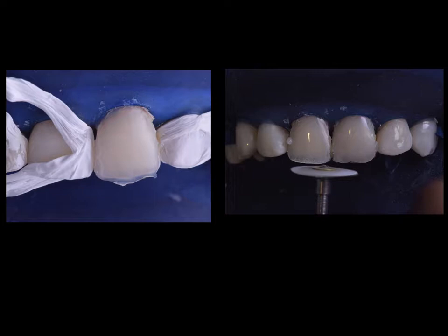As you can see, we used Teflon tapes to separate the teeth. They're highly recommended. You can buy them in any hardware shop. This is the regular plumbing tape which you use for the plumbing in your house. After you remove the template, you will still have some excess. Very easy to remove them.